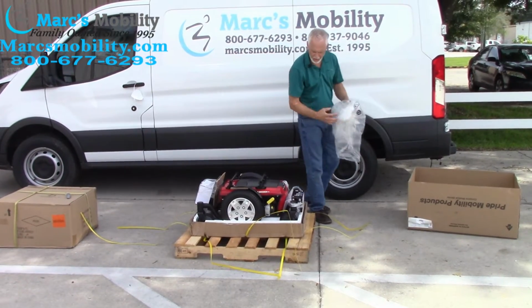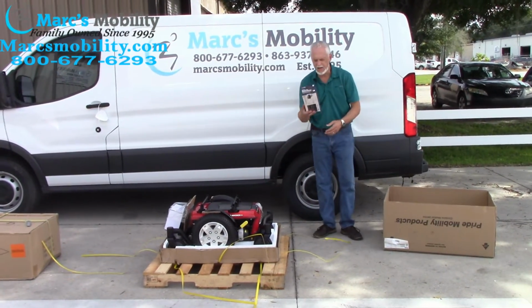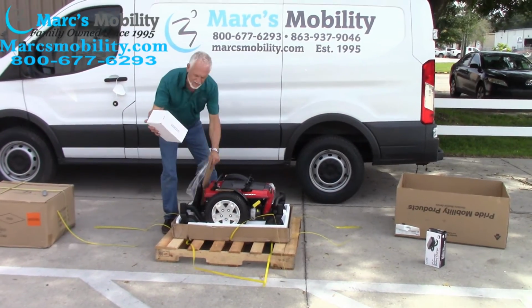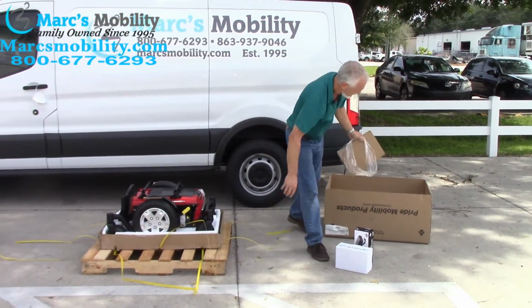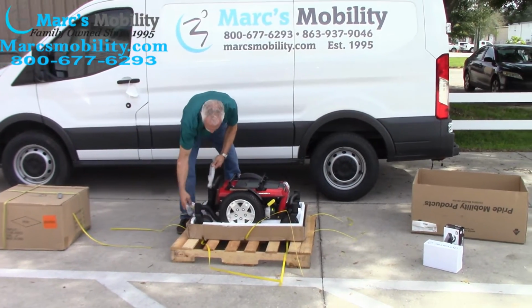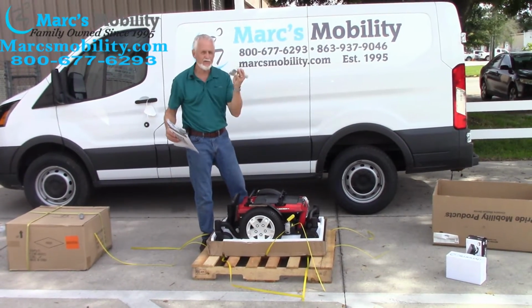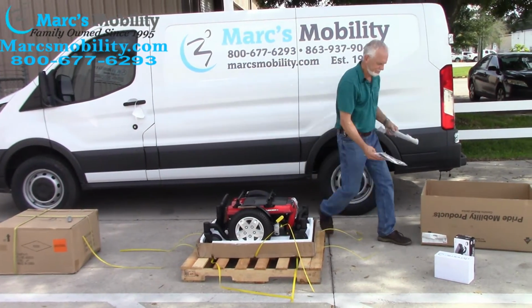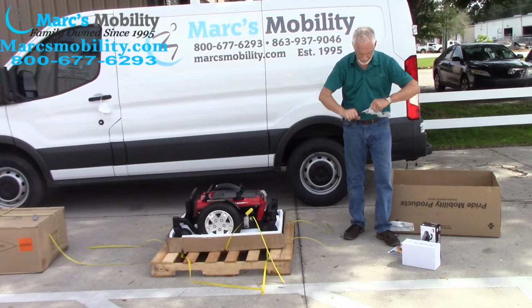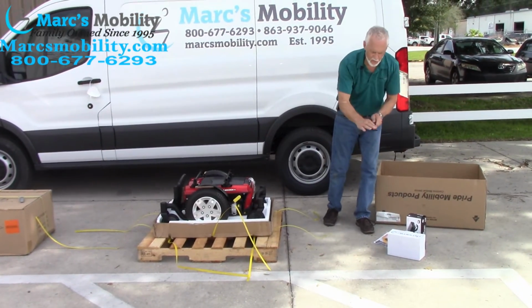Next thing you'll do, you'll take the four-corner brace out. Next, you'll take the covered plastic off. The next thing you'll do, you'll see the charger back here. You'll take the charger out, and you want to keep these parts together so you make sure you have all the parts. On the front, you will have your joystick that goes on the arm of your seat. Under the chair, you'll have your owner's manual and you'll have your bar for your joystick, okay? So you will take the cover off the bar. So your joystick will mount on here with 4 screws.